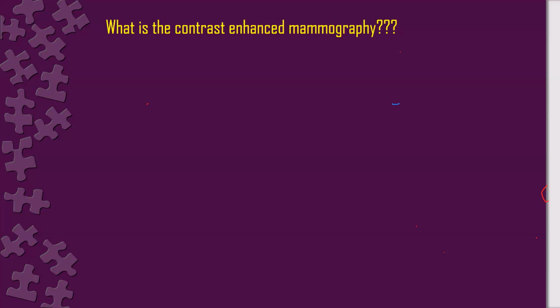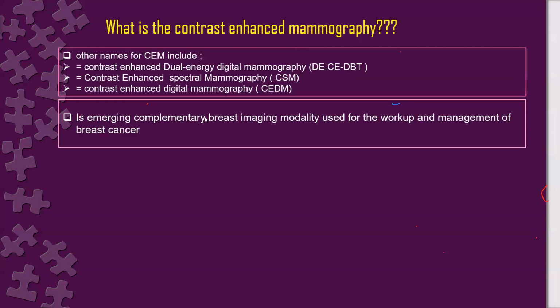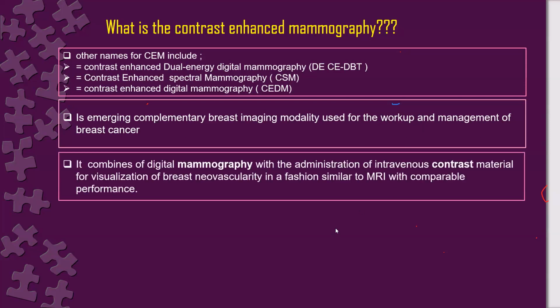Excellent. First of all, there are many interchangeable names for this technique. It can be contrast enhanced mammography, contrast enhanced dual energy digital mammography, contrast enhanced spectral mammography, or contrast enhanced digital mammography. If you hear any of these, it means the same technique. This is at the beginning. It is an emerging complementary breast imaging modality for workup and management of breast cancer.